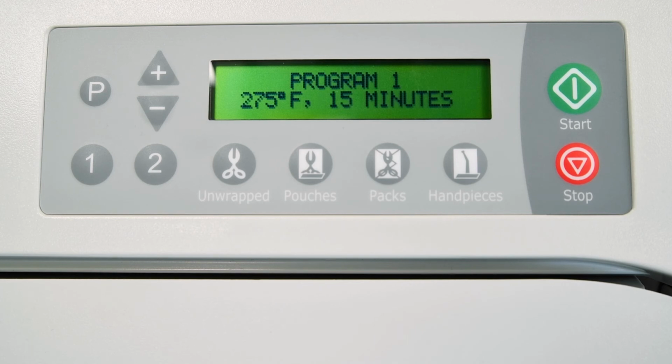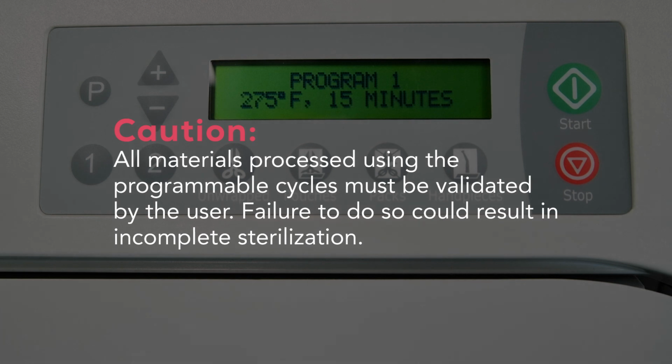If the settings are saved, the display will show the new cycle parameters. The programmed settings are retained even if the power is interrupted or if the unit is unplugged. All materials processed using the programmable cycles must be validated by the user. Failure to do so could result in incomplete sterilization.